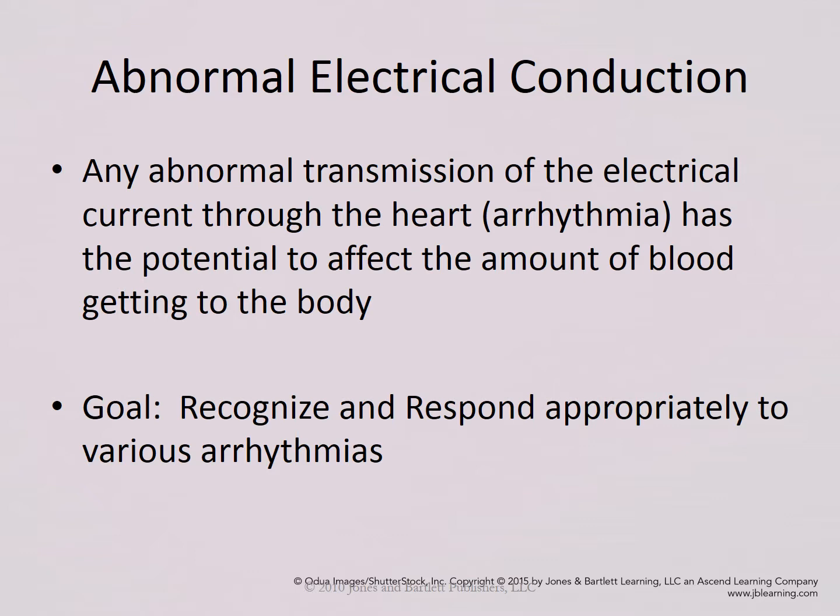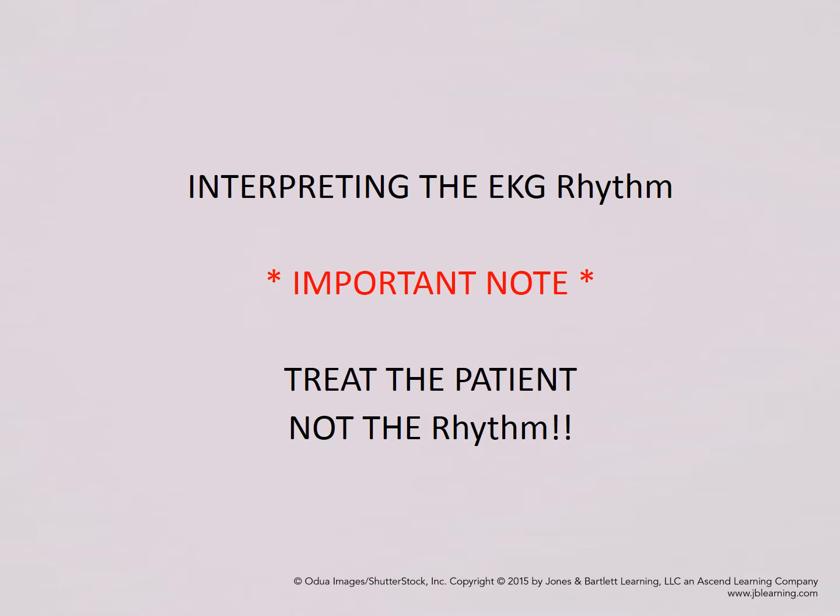Our goal with this is just to recognize and respond appropriately to various arrhythmias. And some arrhythmias have no response from us whatsoever. We just need to recognize it and document it. Let's go on.